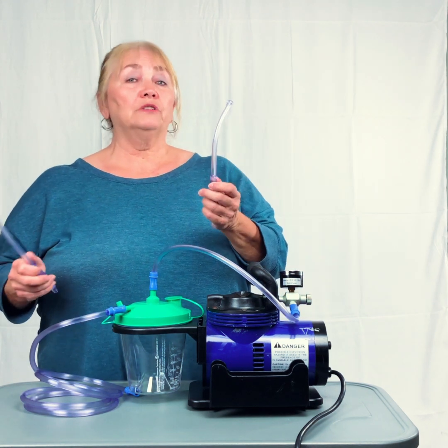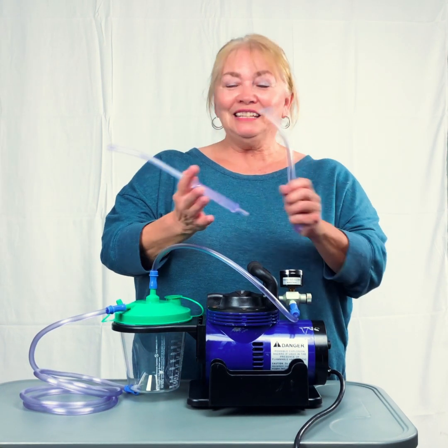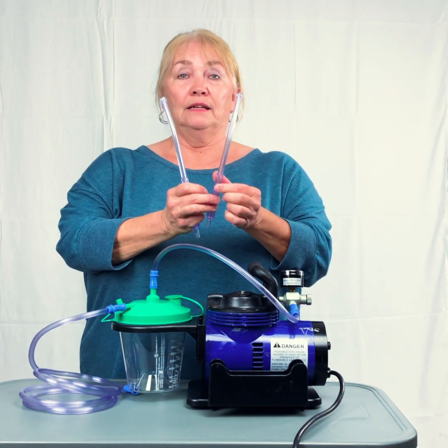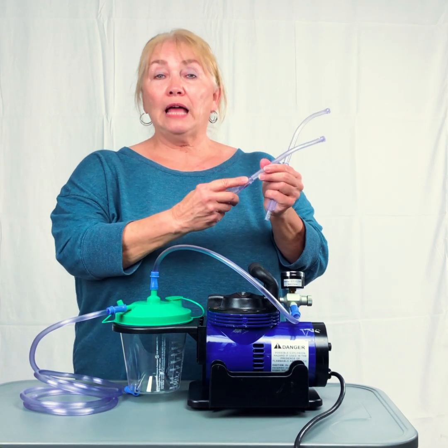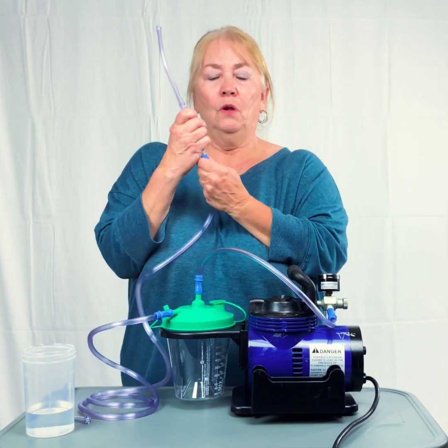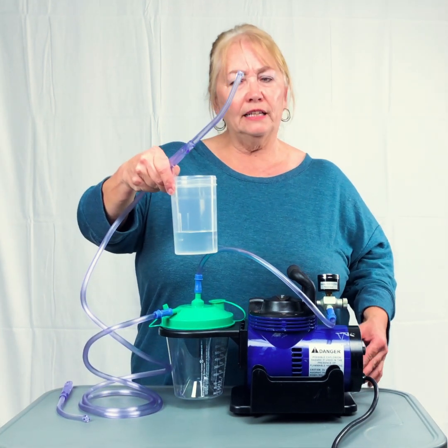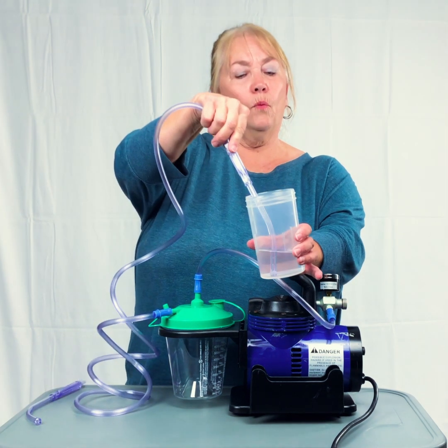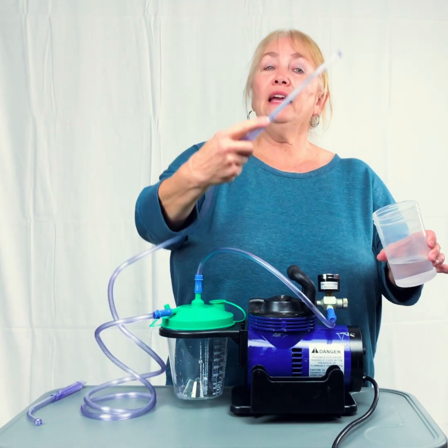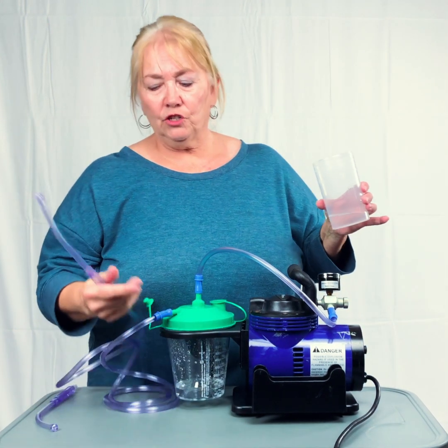There are two types of yankauers that you will see. Some people call them tonsil tips, mouth suckers, different things. One has a hole in it. It's called vented. One does not have a hole in it. It's really important, if you have the one that has the hole in it, your finger goes over it. With the vented one, you take a glass or something with water in it, and we put it over, and it's not really creating much of a vacuum. It's not sucking much up. If I cover the hole, we now have lots of suction.